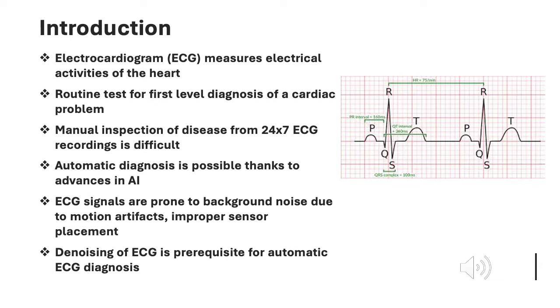However, ECG signals are prone to background noise due to motion artifacts during recording, improper sensor placement on the subject body, and also the induction effect of nearby devices. Hence, denoising of ECG is considered a prerequisite for automatic ECG diagnosis.